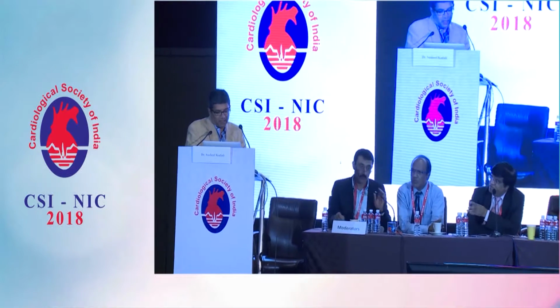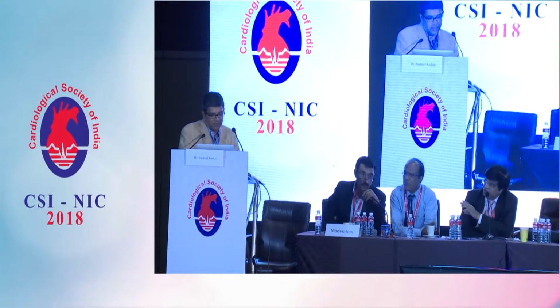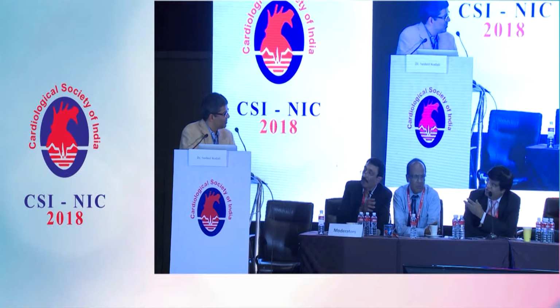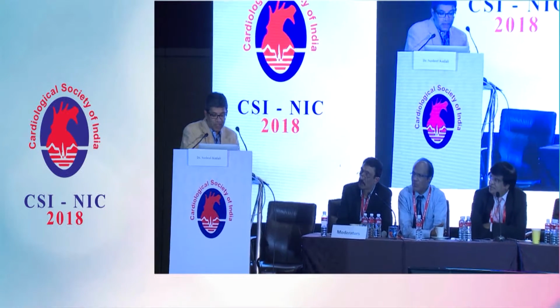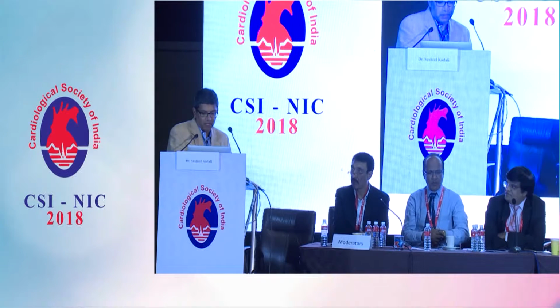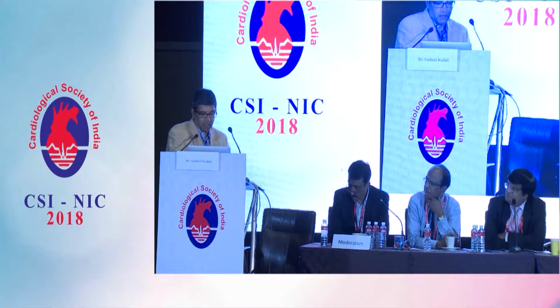Actually, I'll show you one thing. Sometimes you can get away with really stupid stuff. The US was a little slow to catch up with the conscious sedation which Alan Krieger had started off. You were still doing general anesthesia for quite a long time. Yeah, and here's a case where general anesthesia does help us. So, severe LVOT calcium. We did a BAV, everything went fine.